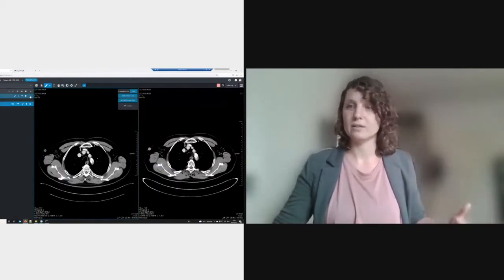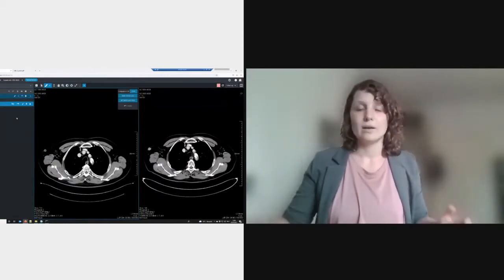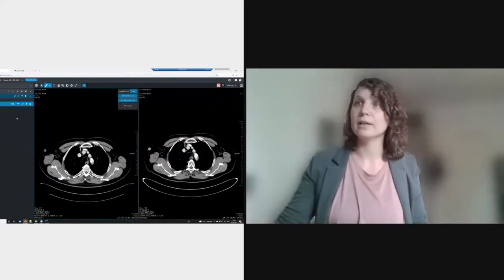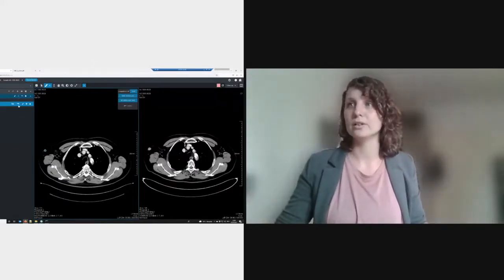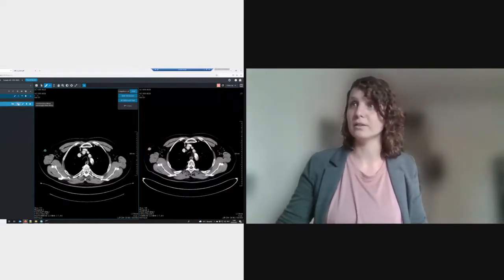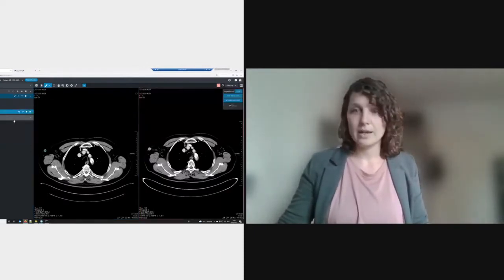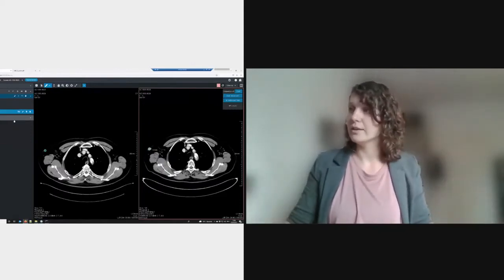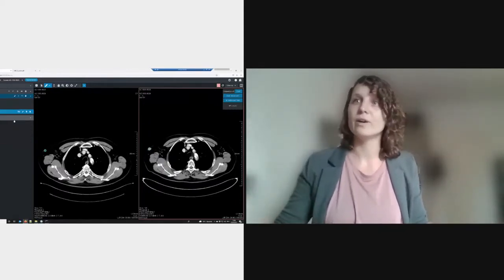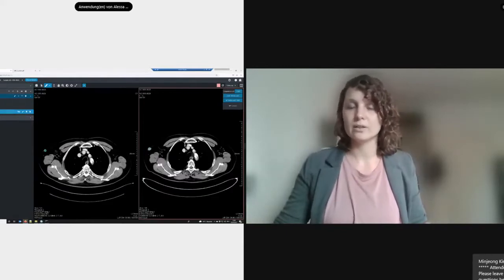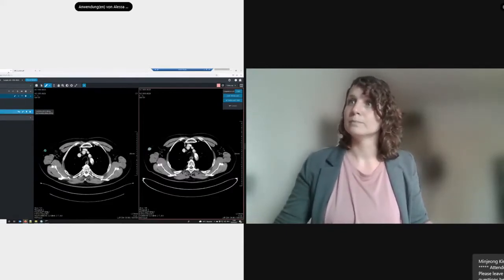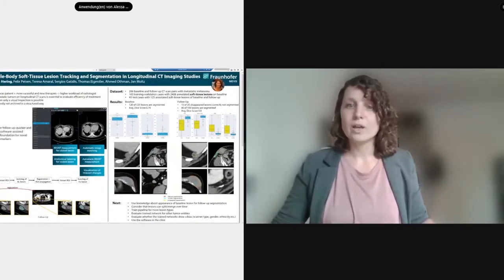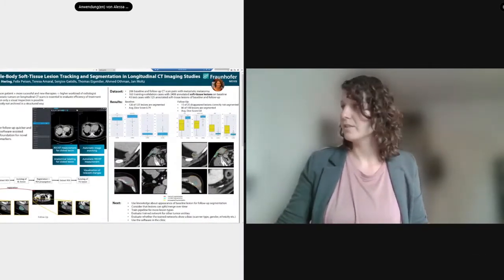When we get the follow-up scan, we can propagate the segmentation to it. To demonstrate, I use this propagate button. Again, the lesion is segmented and measured automatically, and we're done. We now have our structures and can create every data point from them. This works in most cases quite well as you've seen.